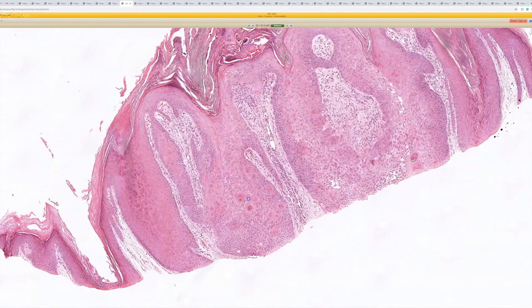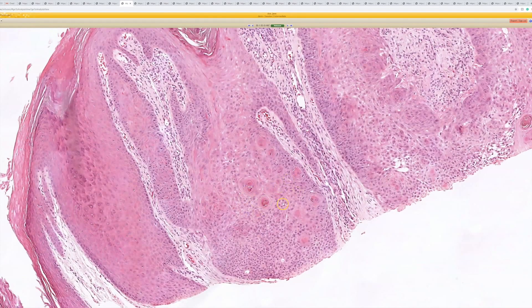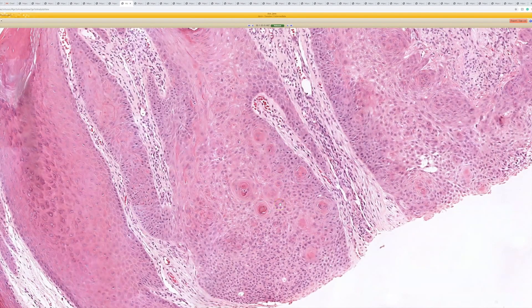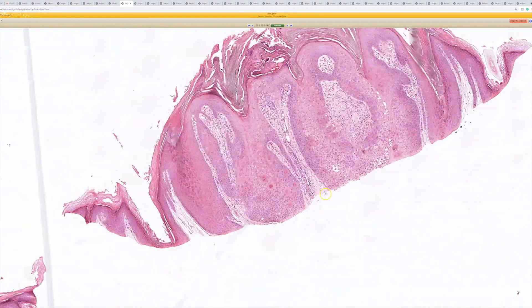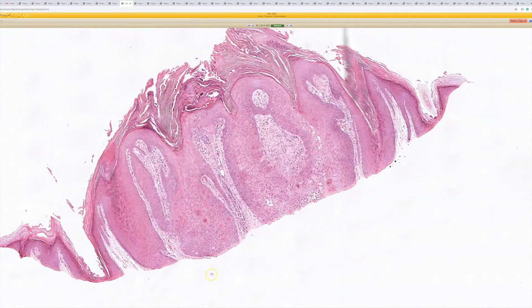This has got keratinocytes and squamous eddies, right? Just like an irritated seborrheic keratosis, but it kind of has this downward pushing borders that bulge down into the dermis.